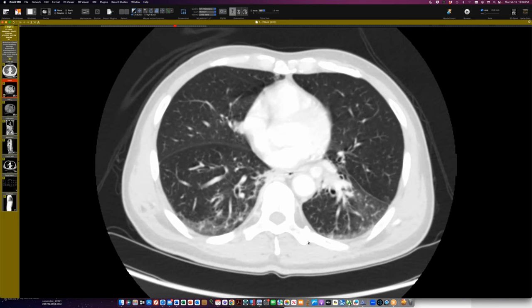I have two theories. First — during embryogenesis, systemic communications along there are present and they regress. Maybe this is like atresia of the lobar pulmonary artery, so they persist because these are clearly congenital given how big they are, not neovascularity. The other possibility is that the pulmonary artery is small and because the systemic artery has much higher pressure, it preferentially perfuses the lung — so as the patient grows, the pulmonary artery just doesn't grow because there's no need for it.